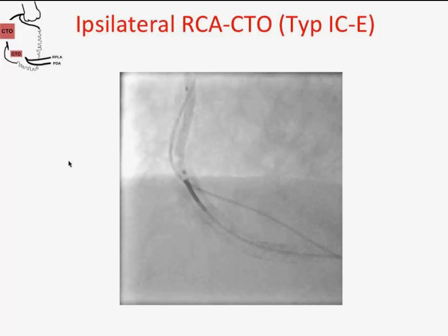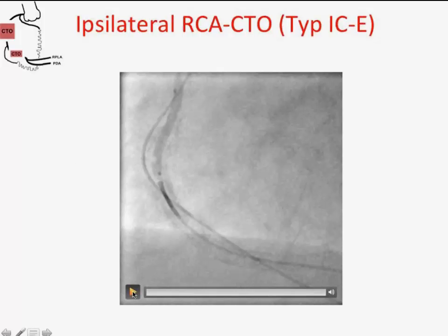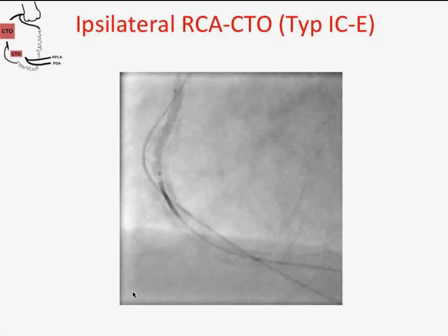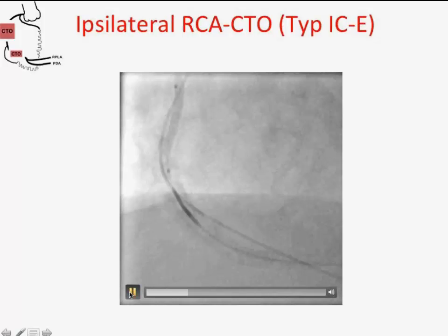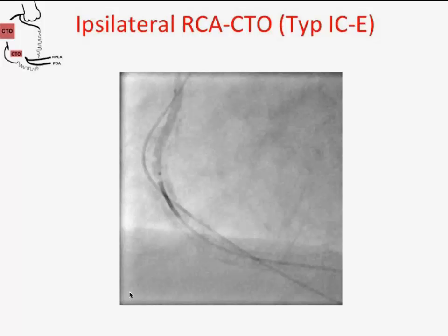This is also very interesting because I blocked the balloon and tried to bring the microcatheter down. And here you can see normally what happened with the Turnpike. It goes like a cone, and sometimes you have the problem of the involvement of the tip of the Confianza. But this tip makes like a cone.